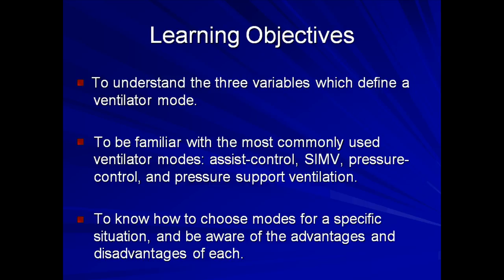The most common place this becomes a difficulty is when physicians and respiratory therapists disagree with the terminology about what mode a particular patient is on. Usually the physician bases their language on what they've read in the textbook about ventilators in the general sense, while the RT bases their language on the specific ventilator being used. Whenever there seems to be a disagreement, I advise just discussing the specifics of the form of ventilation being delivered, and usually you'll discover that you are both describing the same thing.